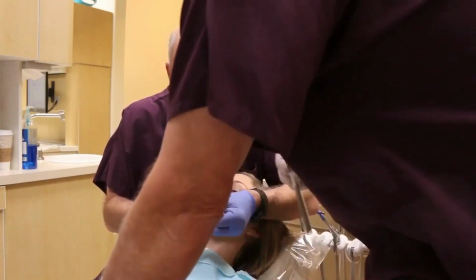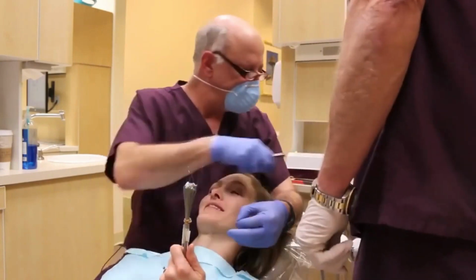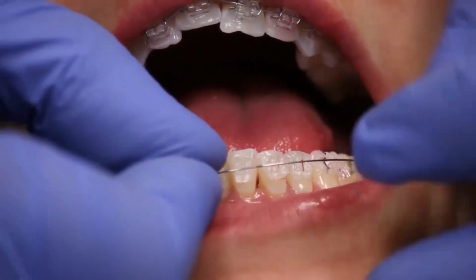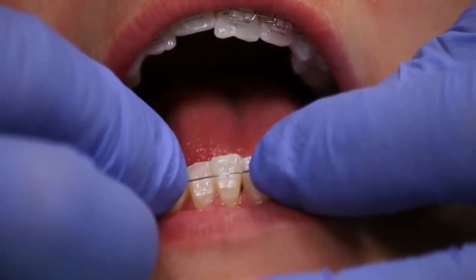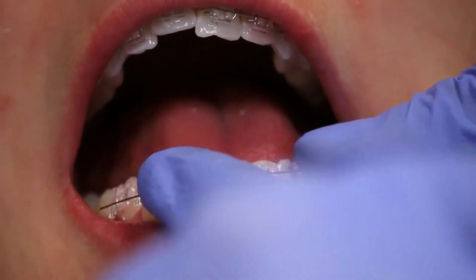We got right distal of that bend. And now we can start tying our arch wire. With this patient, she has teeth that are pretty straight, so there is not a lot of difficulty.